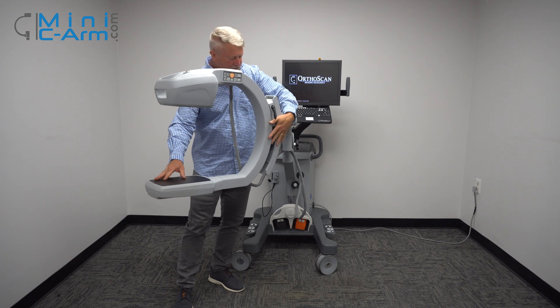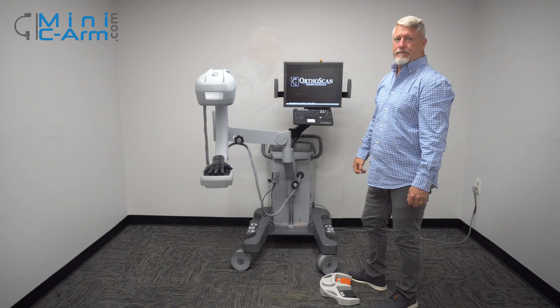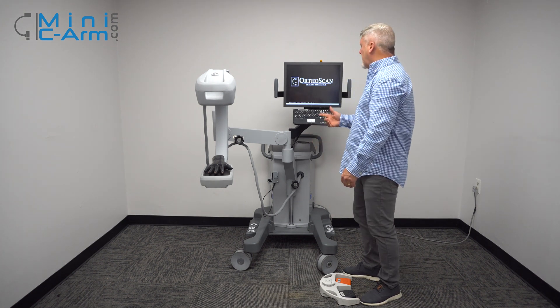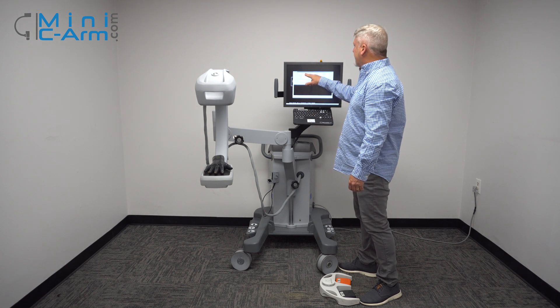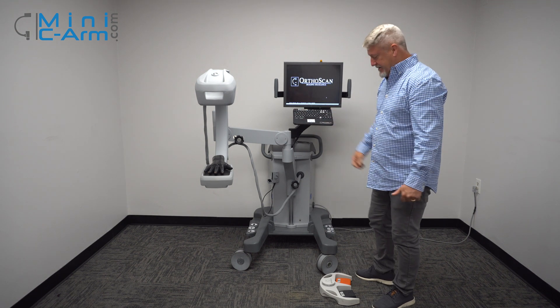It usually takes about a minute or so for it to boot up. Once we boot it up, we can go right ahead and start imaging, or you can add in your patient information — just put your last name, first name, ID, and any other field that you want to fill in. You can edit at any time.